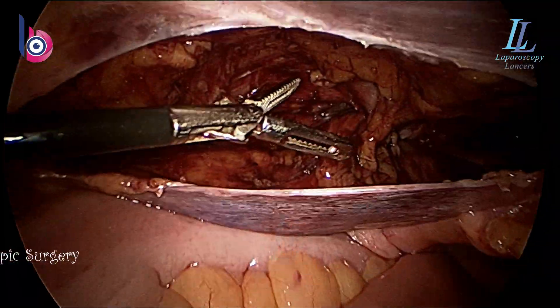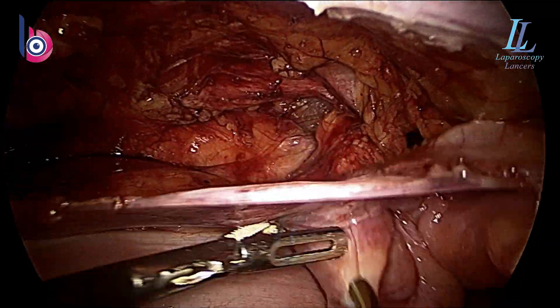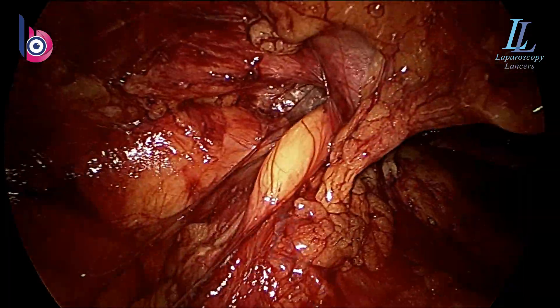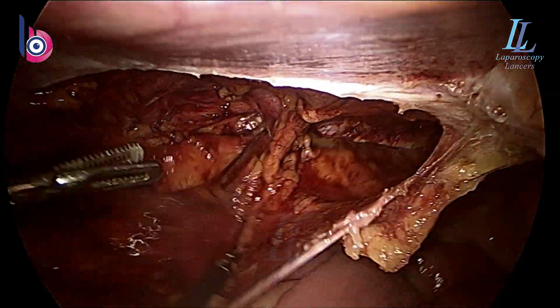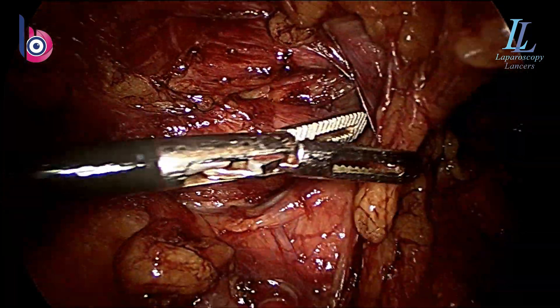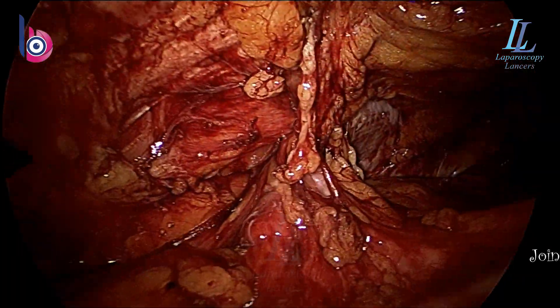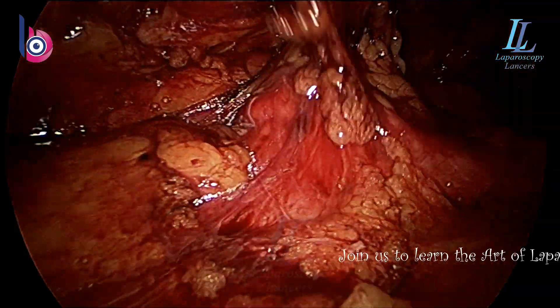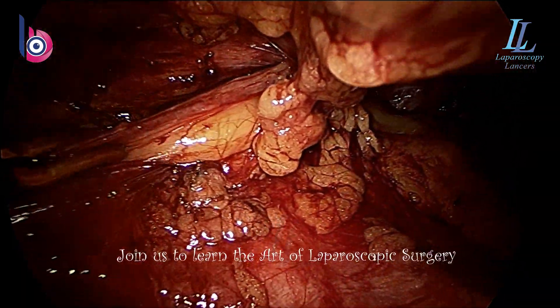As you know, we are thin-fat Indians — we have fat everywhere. There I am confirming if I've reduced the sac or not. This maneuver is very important — it will guide you to where you have reached and where you should proceed further, and will help you in not forming buttonholes in the peritoneum behind. The dissection continues with blunt and sharp pushing. You have to stay away from the great vessels and the inferior epigastric vessels. With time you'll come to know you should not injure these structures — else it will be a disaster. That's why it's called the triangle of disaster.